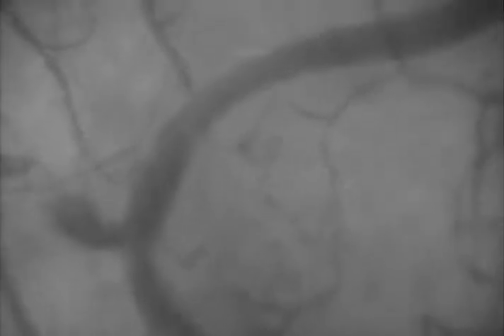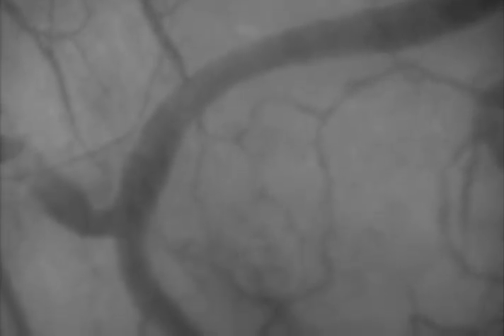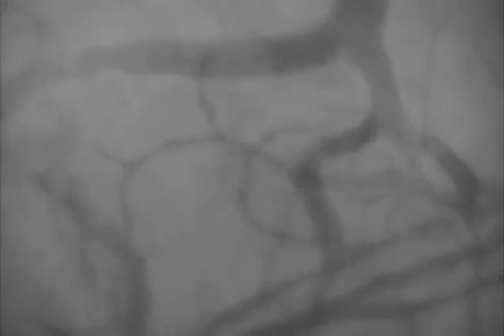Even though this movie moves around a lot, watch the largest vessel. You can see that even though the field of view changes, the flow in the vessel isn't always the same. This is because as the field of view changes, pressure is being applied to the tissue by the probe.